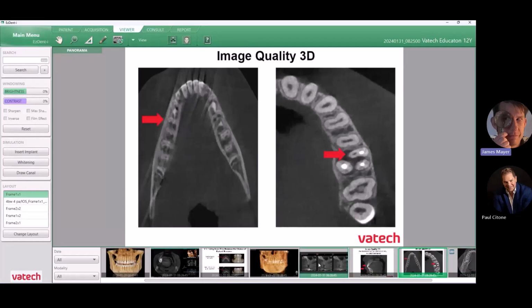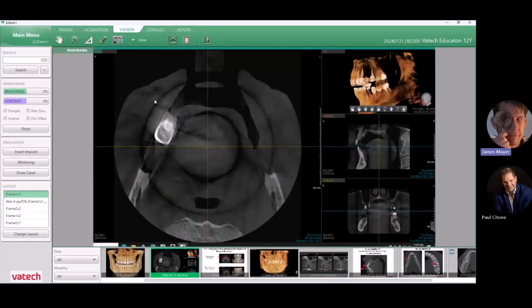Also wanted to touch on something else you may see in the cone beams, and this shouldn't be there. If you do see any circles within the data, you can see here we have one circle, two circles within the axial cut, and some long, dark vertical lines in the other. This is where the device needs to have a beam alignment or some internal adjustments. So if by chance you do see that, that is something else that we would need to have our service team log in and adjust.